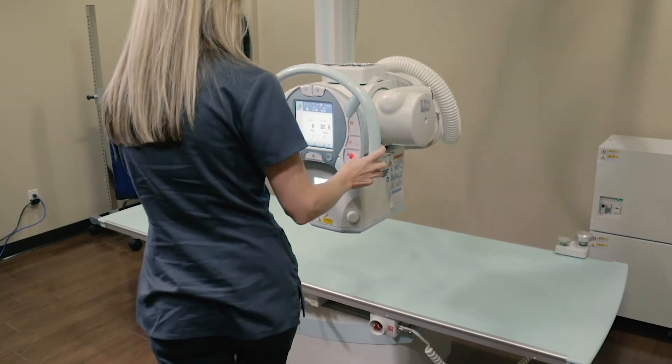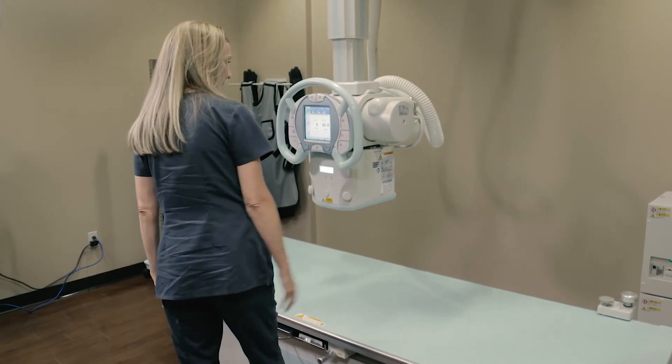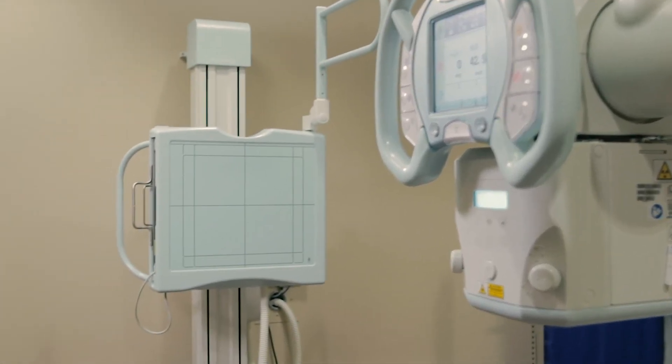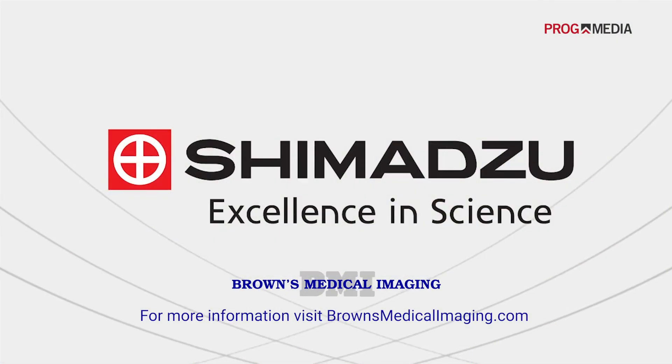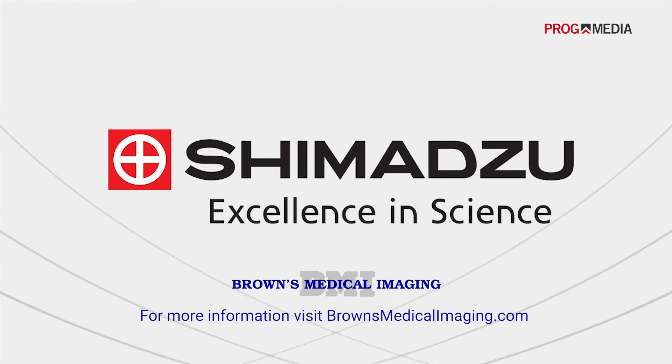The Shimadzu RadSpeed Pro is a robust, versatile system which ensures dependability and ease of use for technologists. Shimadzu provides complete sales and service support before, during, and after the sales process, ensuring the dependability and accountability every customer can count on.